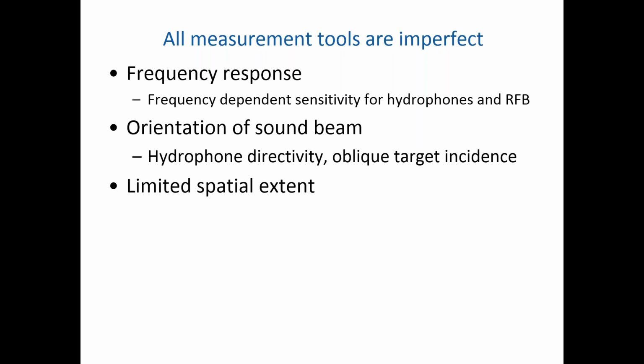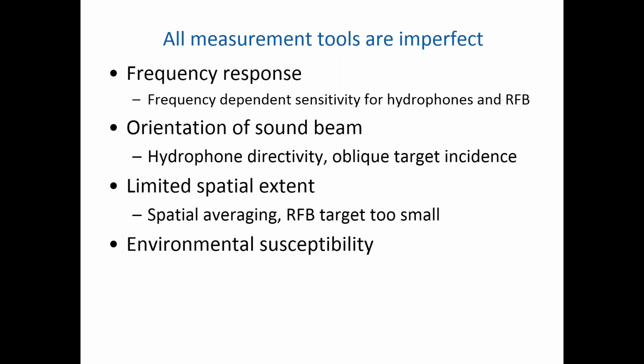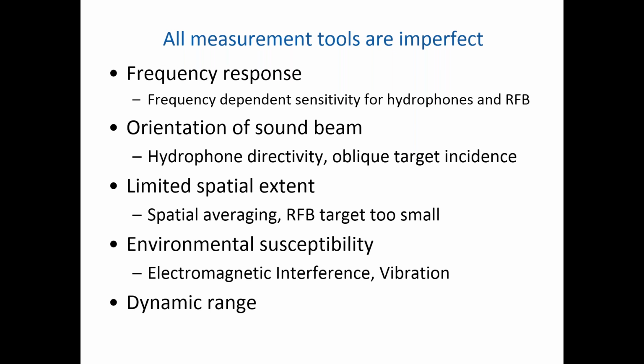We may have issues related to limited spatial extent. And again, I shall be talking about a couple of examples of those. We may have environmental factors which are causing us to exhibit susceptibility. This could be electromagnetic, this could be other vibration issues. And finally, we may want to consider issues of dynamic range. Is our signal too small or too big to measure? And there's also the possibility, as I'm sure Sam Howard may be mentioning when he talks about therapeutic ultrasound, of the possibility of damaging our measurement equipment.